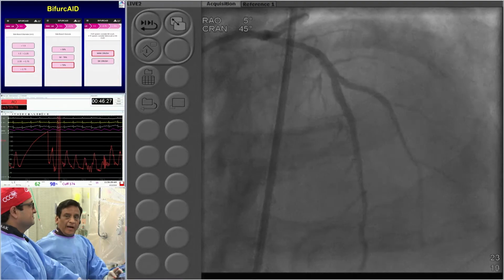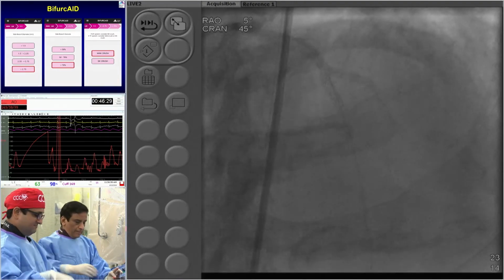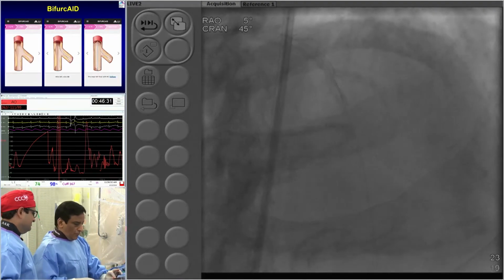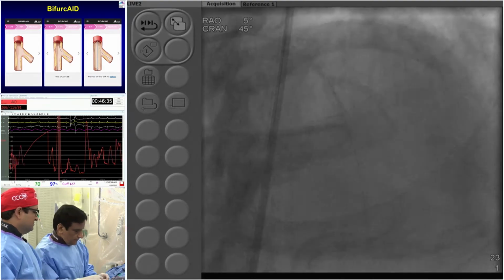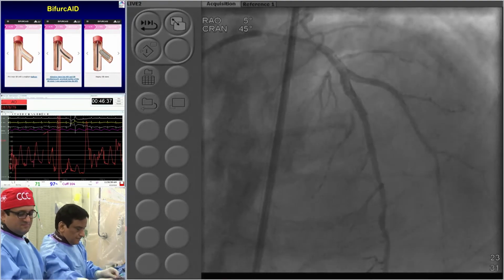Beautiful. Gorgeous. So we're going to come back to you to see the final results. We'll go back to Dr. Kinney in room 1. Let's go to Dr. Kinney in the meantime.